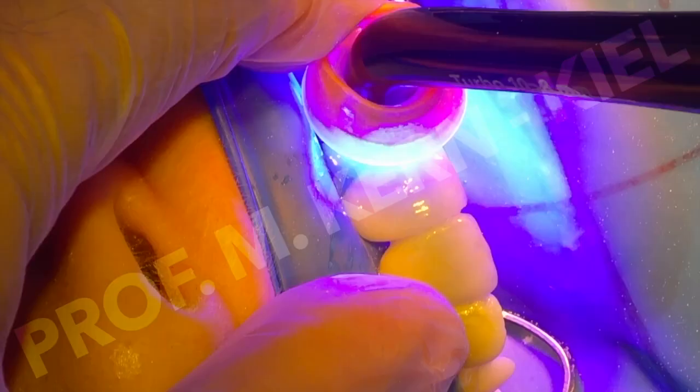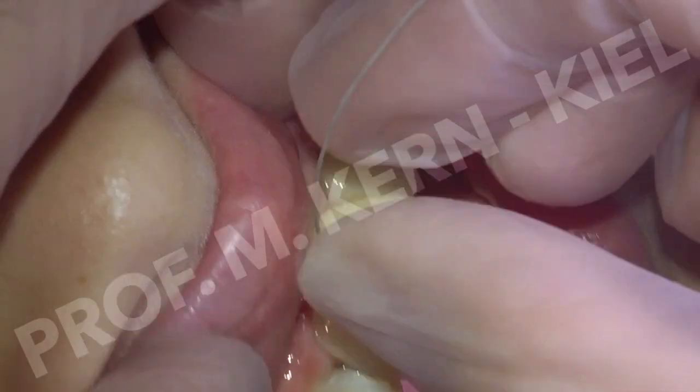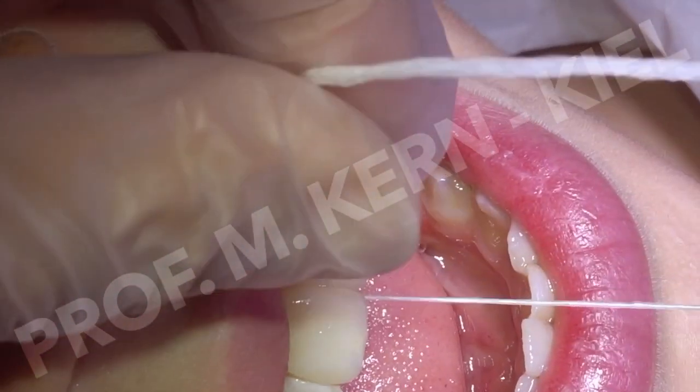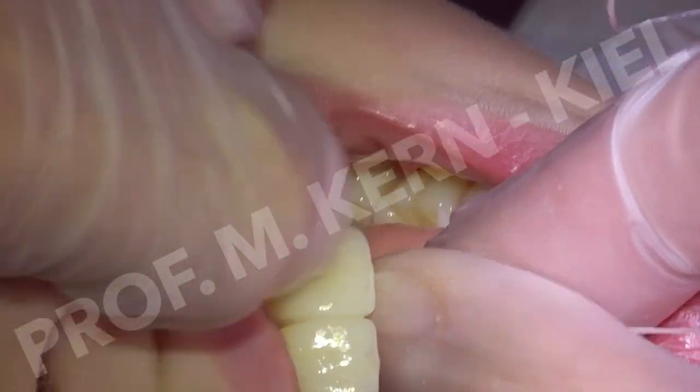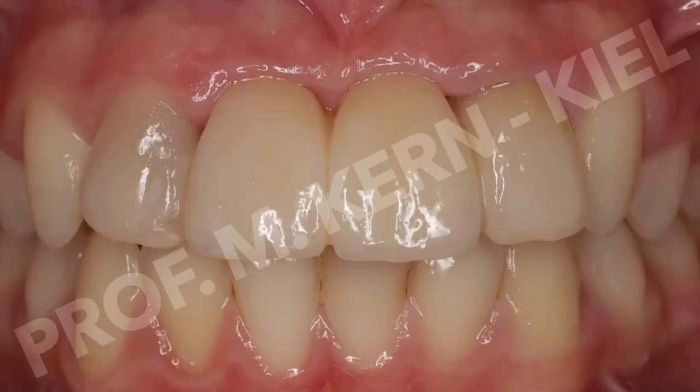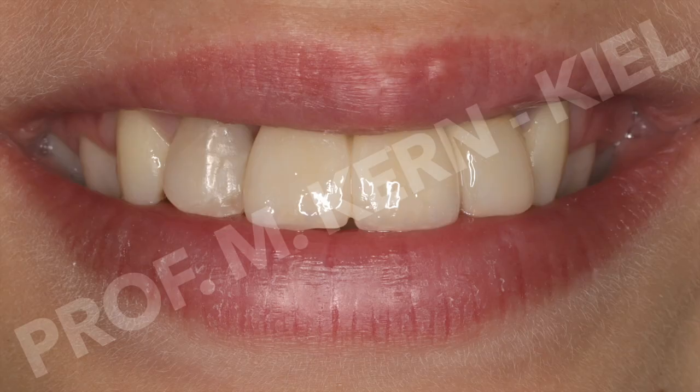After checking function, the patient was instructed how to clean the pontics with dental floss. The patient and his family were very satisfied with the improvement in aesthetics and function achieved through this minimally invasive treatment approach.